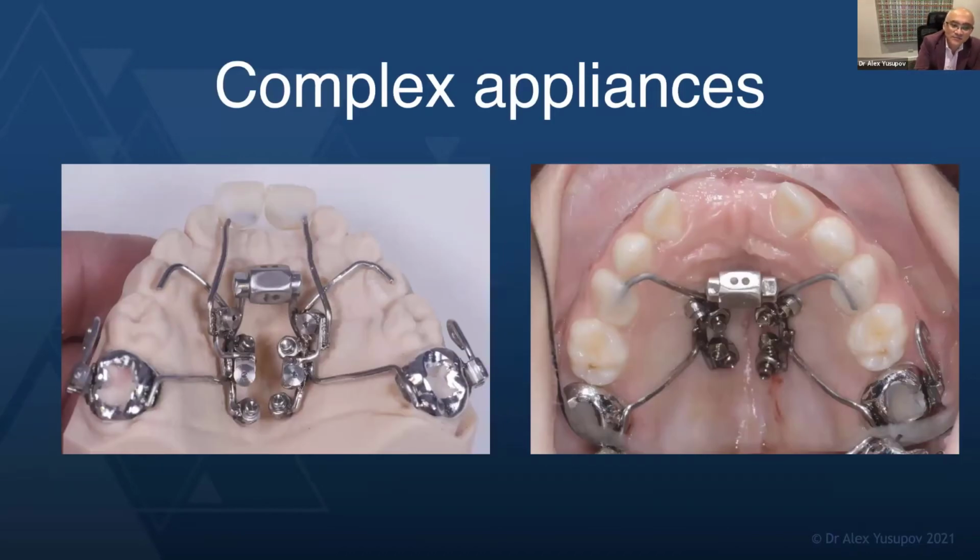And this is probably like the pinnacle of inventions. This is a patient that has a lot of impacted teeth and cleidocranial dysostosis, and he's been without those 2 teeth for a while, and we needed to get some more expansion. He's class 3 as well, so we need some protraction. And at the same time, we want him to look good, so we've added some removable false teeth on the same framework that is held together by 4 TADs on the roof of the mouth.